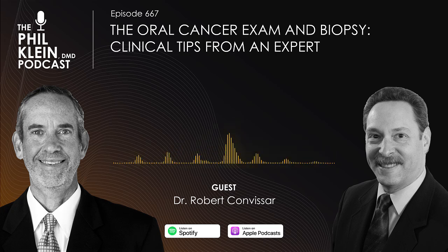You remember those old denture marking sticks you would use to mark denture sores? Well, those are great little things. You're looking at the lesion, you have the goggles on, you can see where the margins are, and you take these little denture sore spot marking pencils and you draw a line around where the margins are. Makes it very, very simple. Then you take your 12B blade or 15 blade or whatever, you remove it, you're all set. Simple, easy, no big deal.